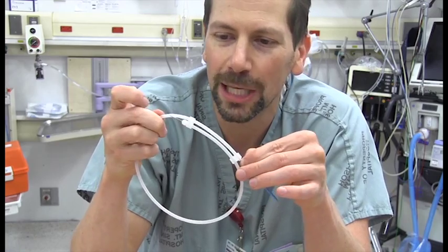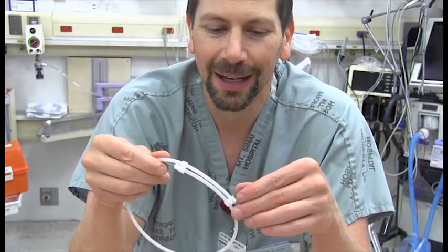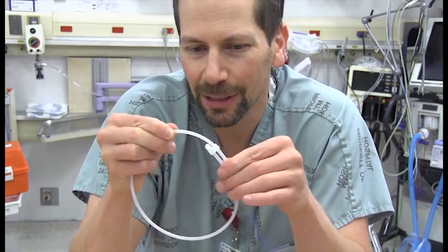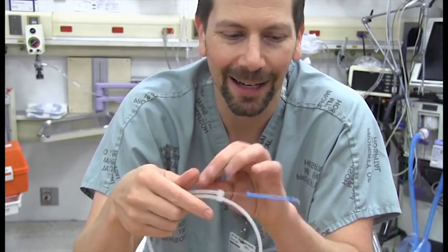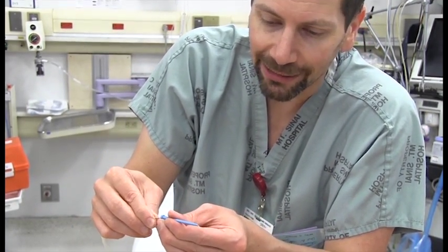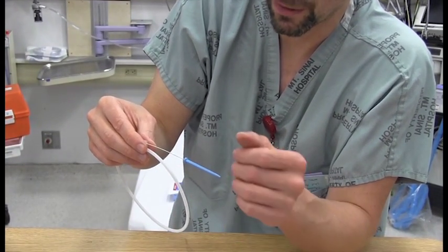Its whole purpose is to keep the wire from moving. That's going to be deleterious to you moving the wire. So step one, whenever you get one of these, is to actually pull it so it's disengaged from that little packing area. And then you straighten out the J tip. And I actually like to advance just a little bit of this wire for a reason I'll show you in a second.